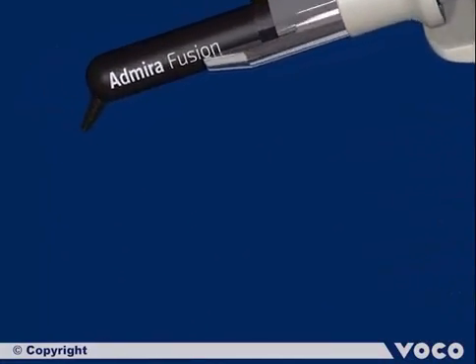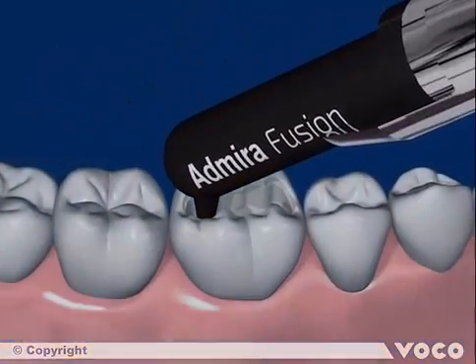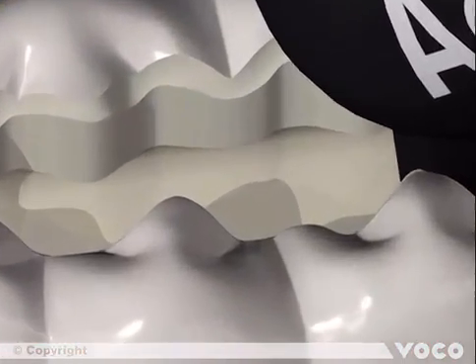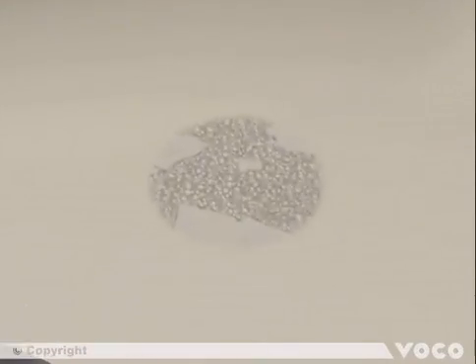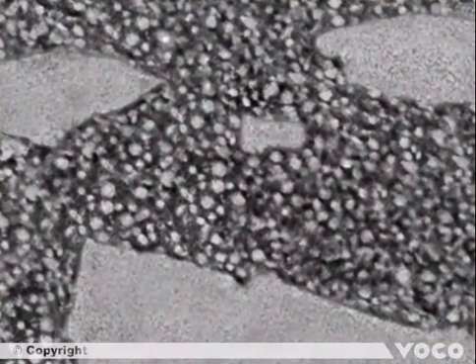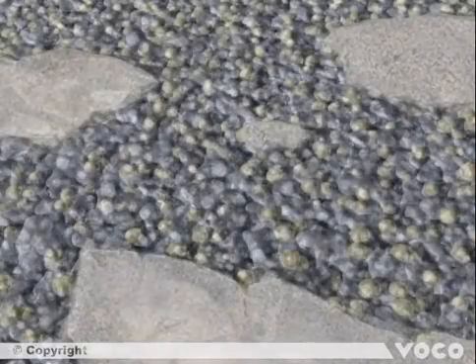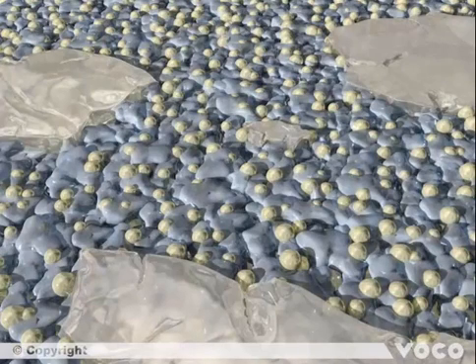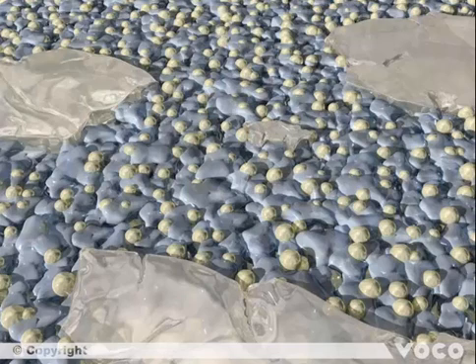The first increment of Admira Fusion is directly applied into the Class 1 cavity and adapted. Before the curing process starts, we take a closer look at the inside of the material. With the help of the transmission electron microscope, it becomes obvious that Admira Fusion contains a mixture of different sized glass particles, nanoparticles, and Ormocer resin. All three main elements are based on silicon oxide — a unique structural characteristic.